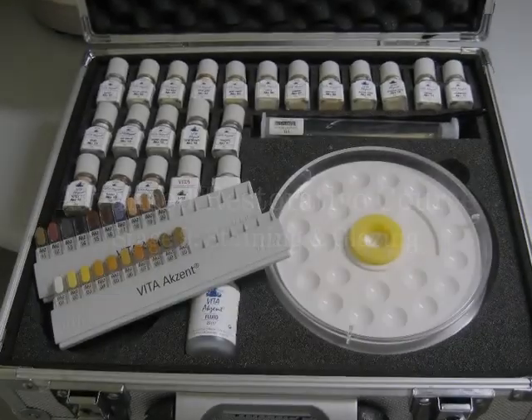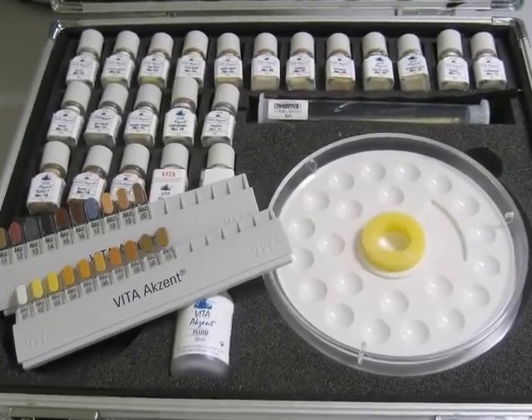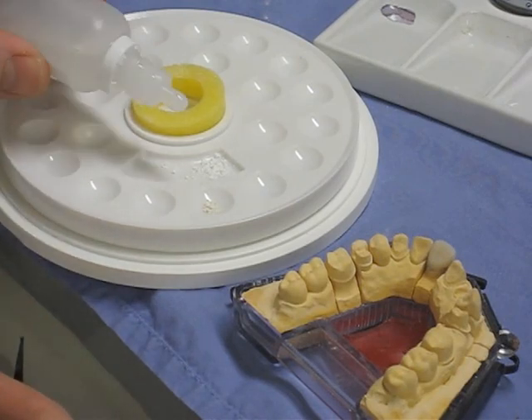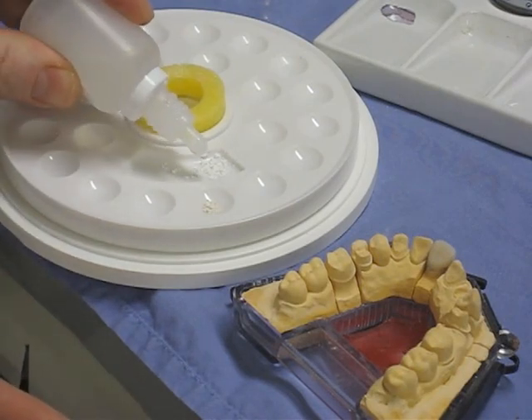In this stage, we're going to stain and glaze the finished crown. This is the stain kit with a little colour chart there. They're mixed in much the same way as the ceramic powders for the main crown build-up, but in smaller quantities.